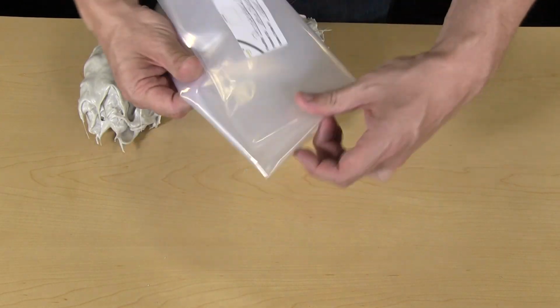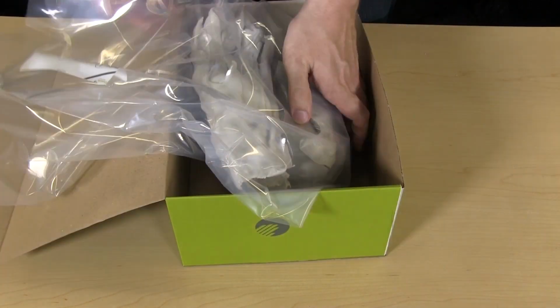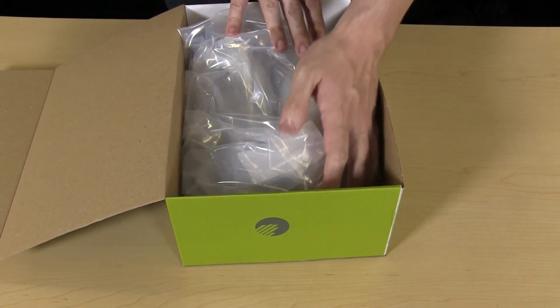Place the impressions in the enclosed shipping bag. Now place the bag with impressions and the container opener in the shipping box and return to touchbionics.